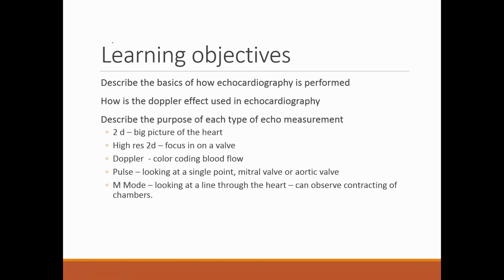I think the first thing is, what are the basics? Echocardiography is basically shooting sound at an object. And it's really high frequency sound, such a high frequency you can't hear it. So you have a probe that shoots those waves. They get reflected back.